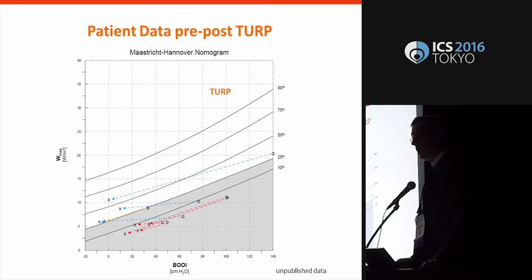before and after TURP. And this patient in blue is a treatment success. No symptoms whatsoever, no post-void residual, and he is healed, he's fine. This patient comes from this area, he has been resected, and he's fine. This patient comes from this area, he's fine. But these four patients, coming from a Detrusor underactivity area, resected, so there is a reduced bladder outlet obstruction, they remain with post-void residual urine and LUTS. So these patients are non-responders, and the blue patients are responders.